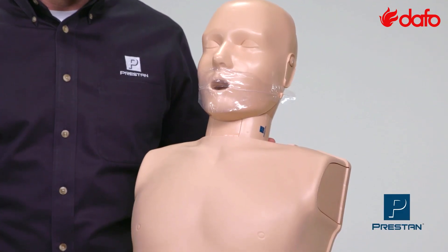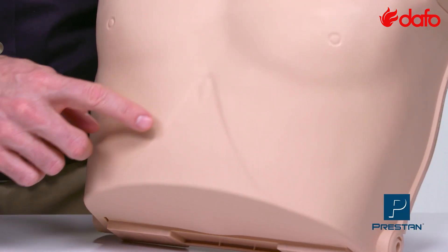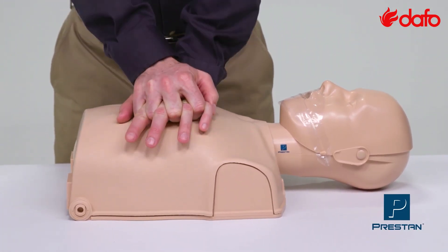As with all Prestan products, the Ultralight Mannequins are realistic with anatomically correct features and easy-to-clean skin. The piston allows for realistic chest compression resistance and depth.